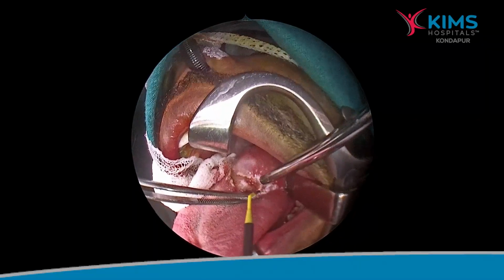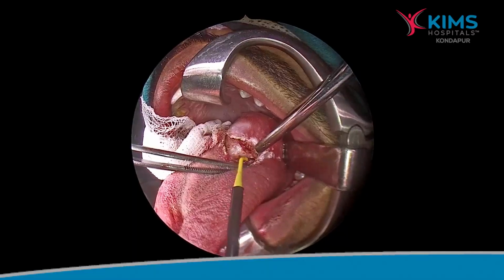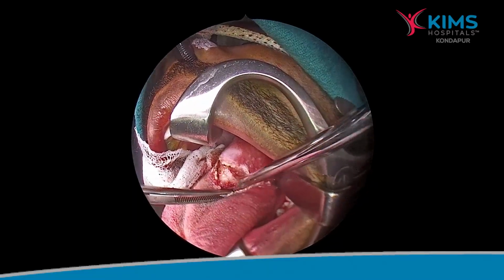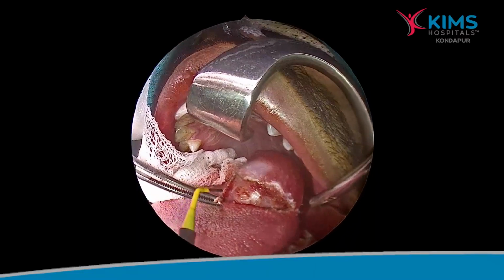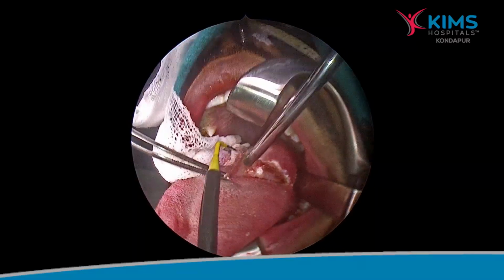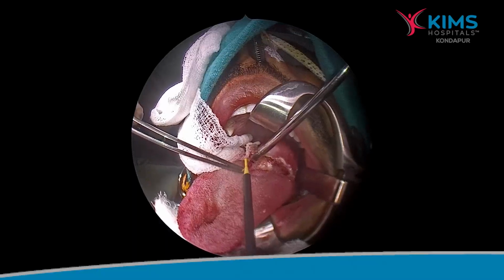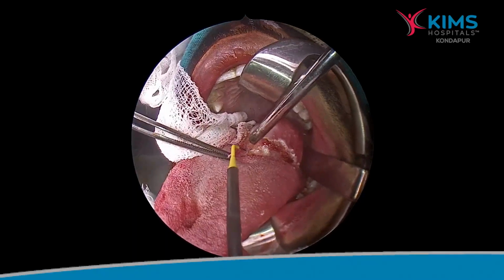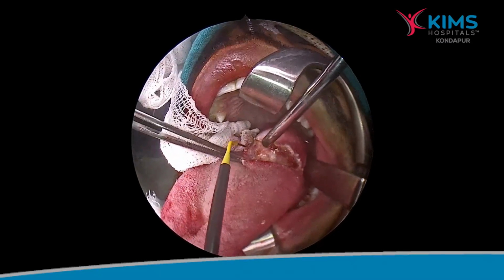Proceeding from the anterior border, I am going lateral. I am approaching the lateral border. You can see the tumor there. I am not incising into the tumor. From the looks of it, most probably it may not be any hemangiomatous tumor. It looks like a solid, firm, encapsulated tumor, which is a good thing for us.